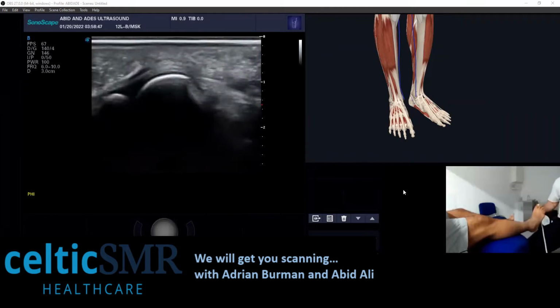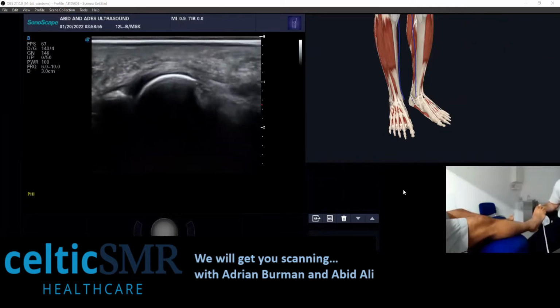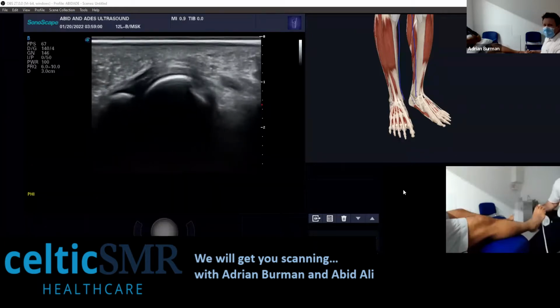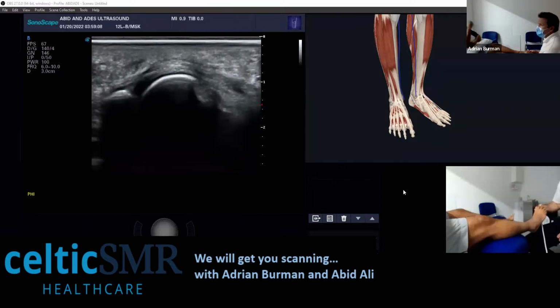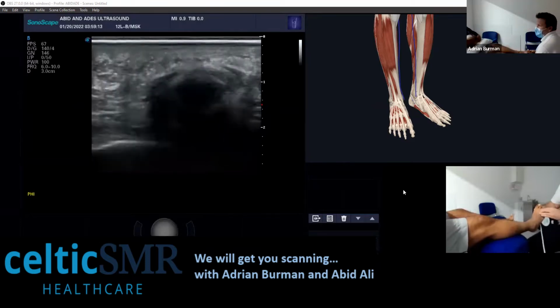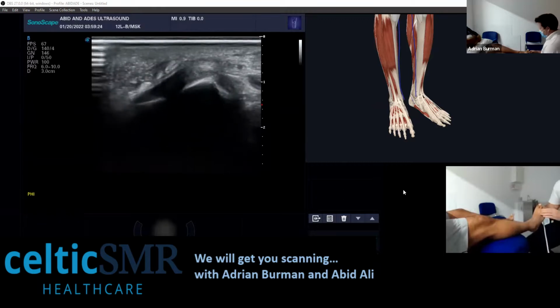Adrian, what sort of frequency? So this is on about 6 to 10. Okay, thank you. So I think the one I use at the hospital goes down to about 9, and I tend to whack it down to 9, and that tends to be ideal. Where do you prefer your focus? So where I'm expecting to see the neuroma, really. So I come across into the space, then I'm roughly expecting it to be right across where that focus is. And you're in long axis there, so you're just scanning over the.